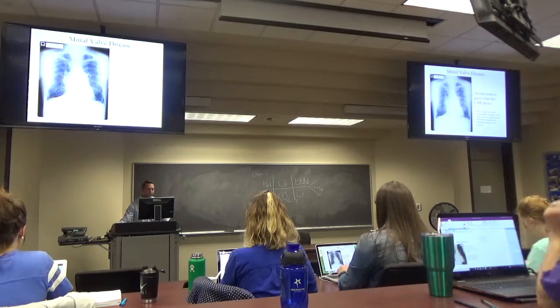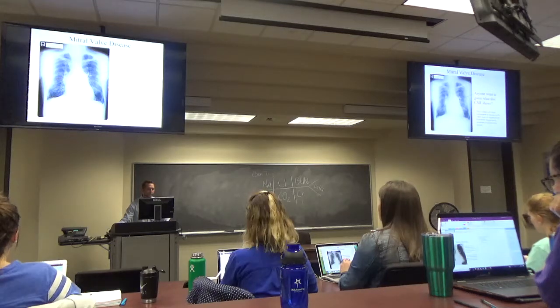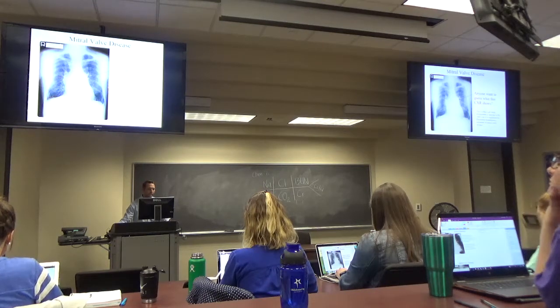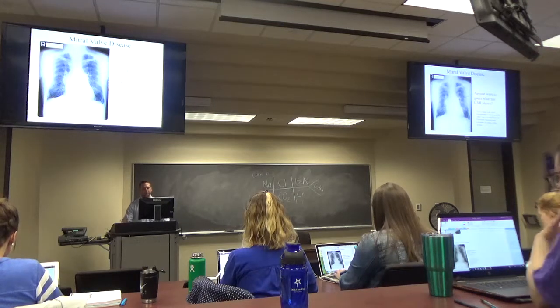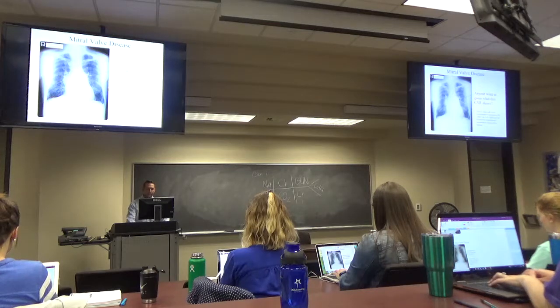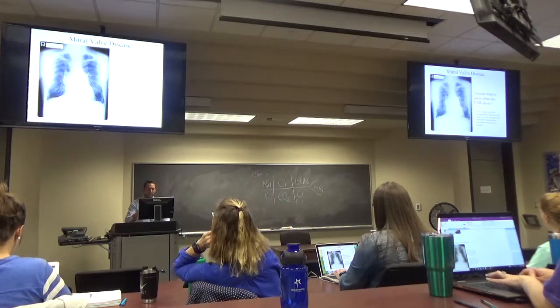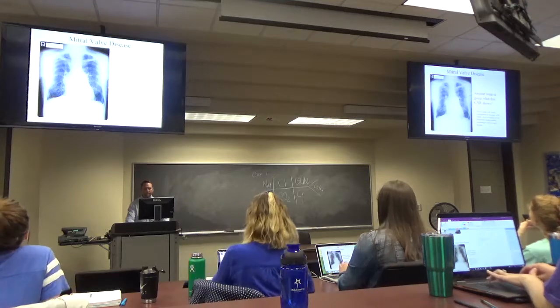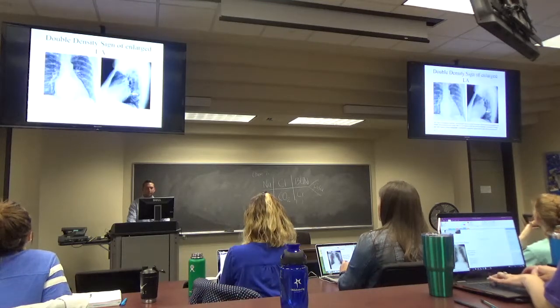And significant here, this is a better picture of pulmonary artery hypertension. So it almost looks like a hilar mass. There's a different radiological sign called the hilum overlay sign, and I won't get into that again, but that's a sign that shows that you have pulmonary arterial hypertension instead of a hilar mass.